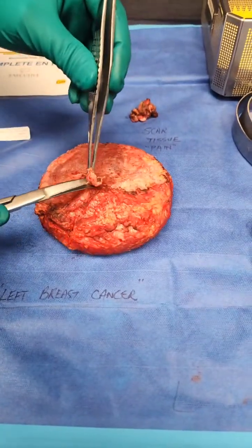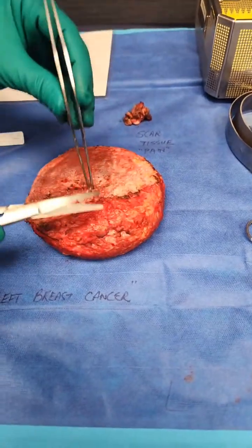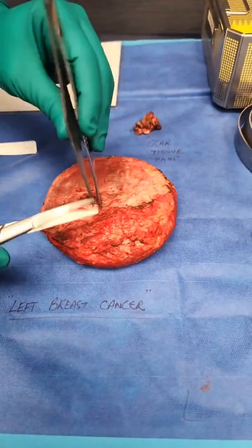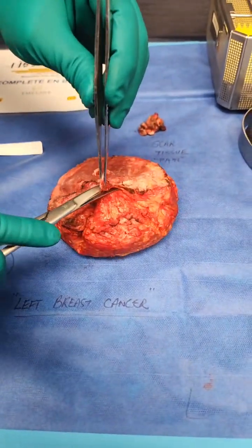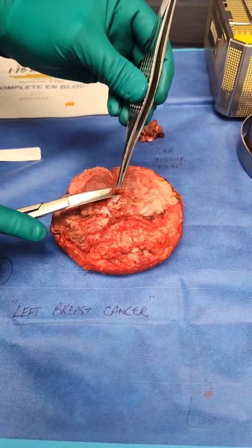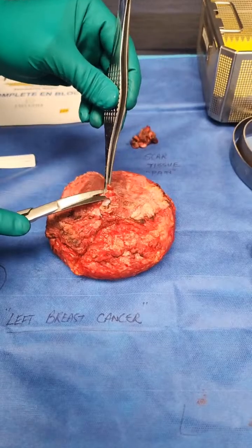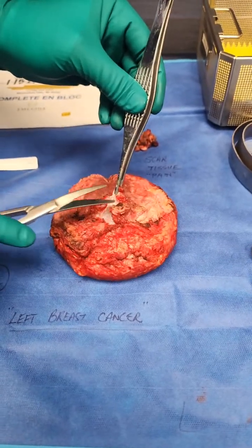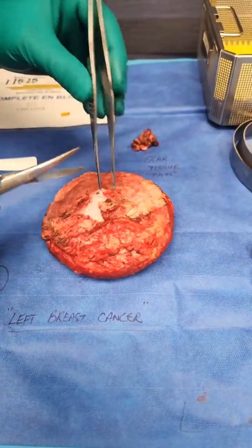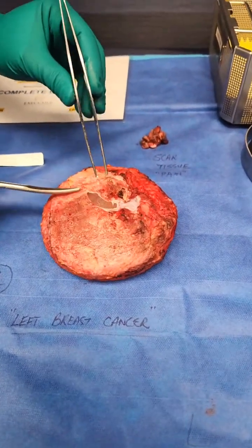Look at how thick the scar tissue is. All of this tissue needs to go. Go in from here. There we go. So as I go in, I purposely chose this side. You can see this is very thick. You see that white band?